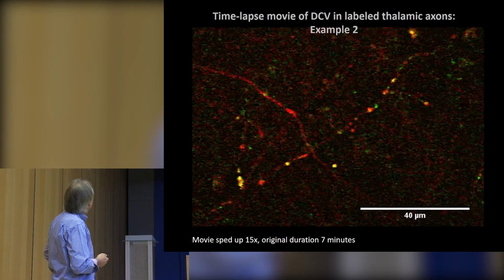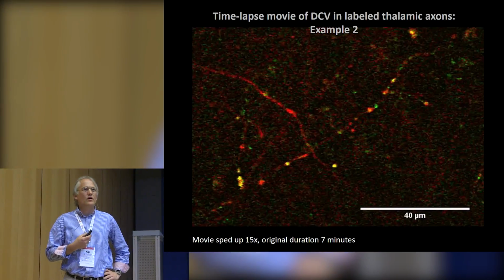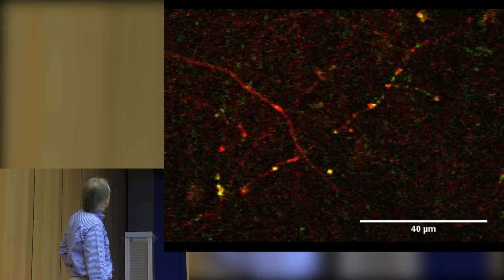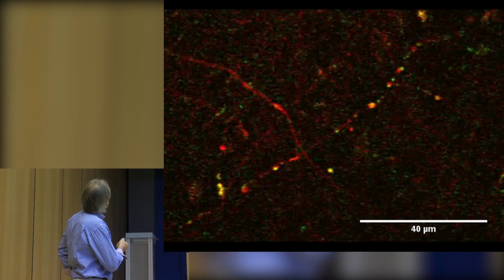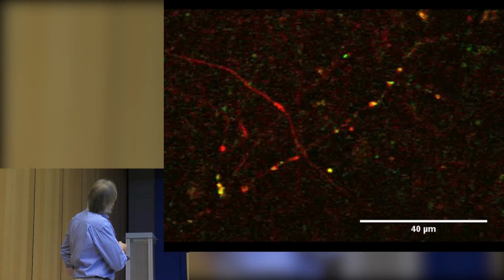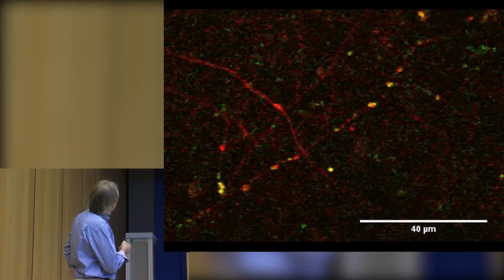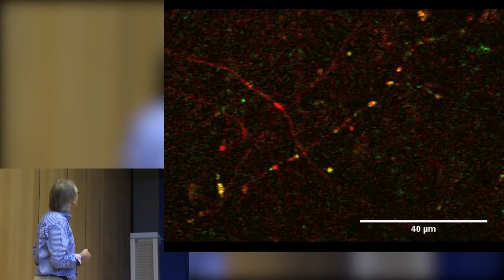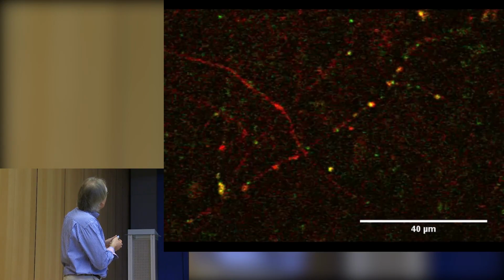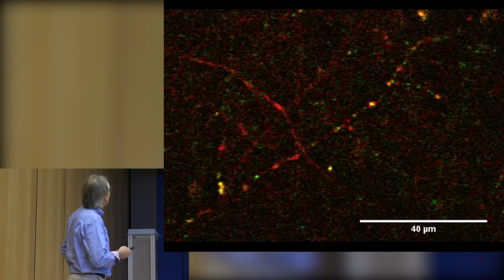So now let's look at a different example. So this is at the other end of the spectrum. So this is an example that is not, in terms of optical imaging, ideal, but still analyzable. And you can see there's more background fluorescence lingering around here, all these green kind of dots that come and go. But you can still see, we can clearly resolve trafficking vesicles here. You can also see that here the motion correction didn't work as well as in the previous example. However, I think the basic principles are still the same. You can see those presynaptic terminals here, and we can see vesicle trafficking going on in different directions.